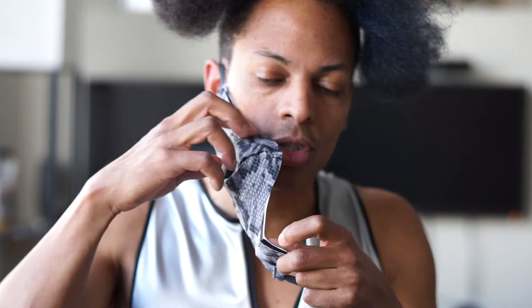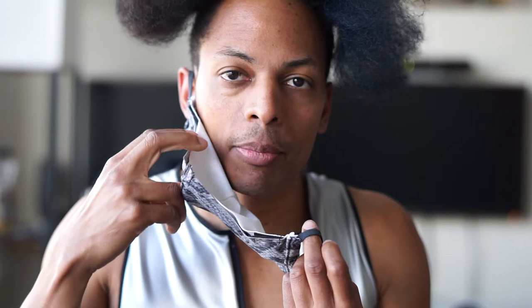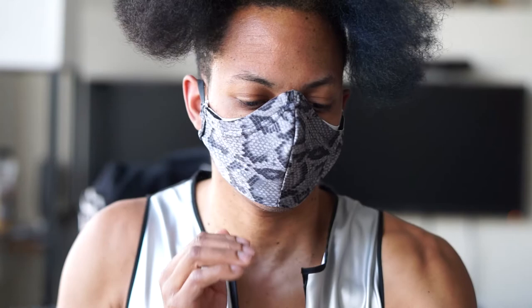But just to show you — even if you aren't able to find a HEPA filter, you're still providing some protection for yourself. I'll demonstrate by doing the same blow test without a HEPA filter inside my mask.